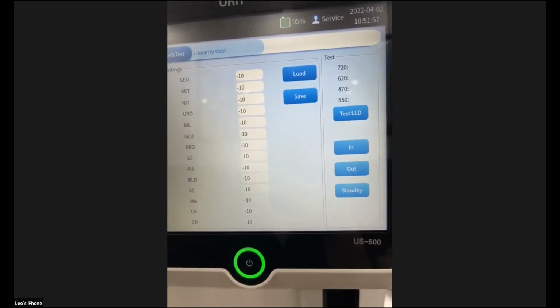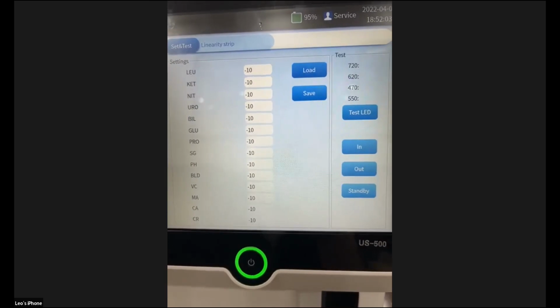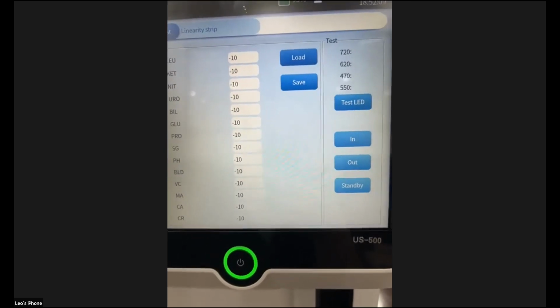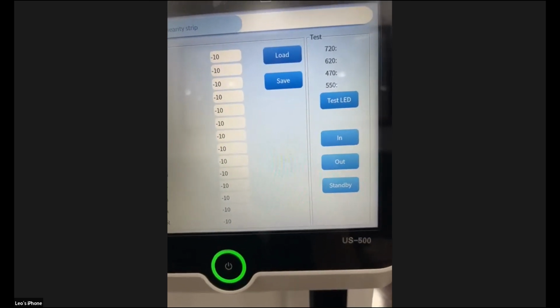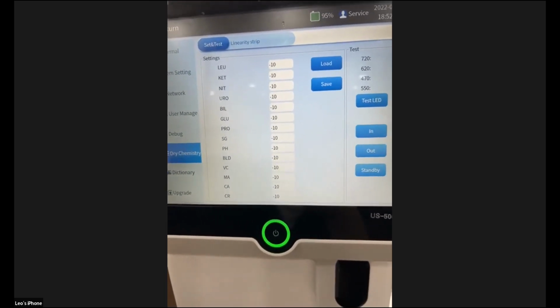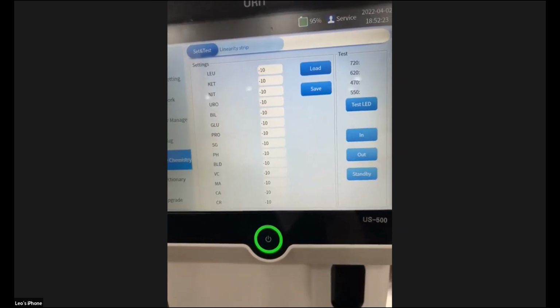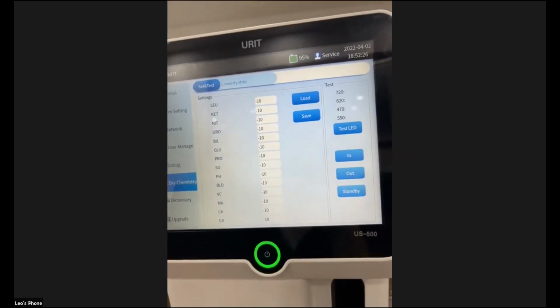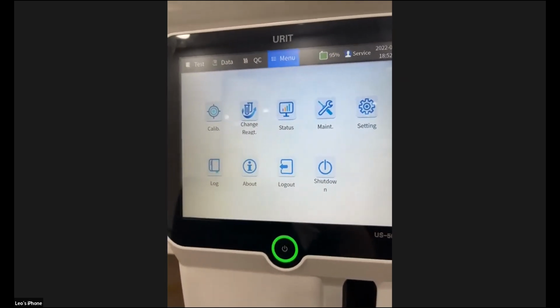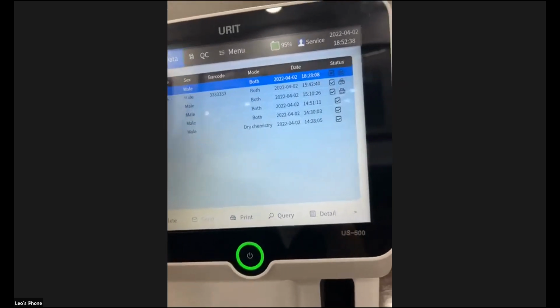Do you remember the same situation in the 1600? You wanted all of the results to be no more than 2+, because you think the 3+ and 4+ are too much for your patients and customers. You just need 2+, so I think we need to change the grid table. So those are the two methods we can use. Is that clear?